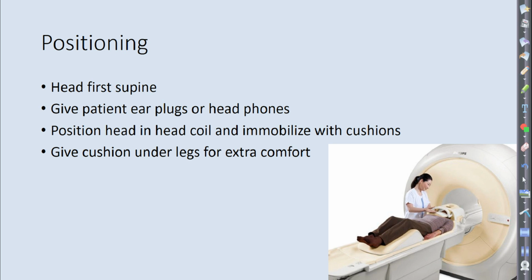Head first supine. Remember, you can steal all these slides for your presentation. Don't reinvent the wheel. Just copy and paste. I don't care. That's why it's there.